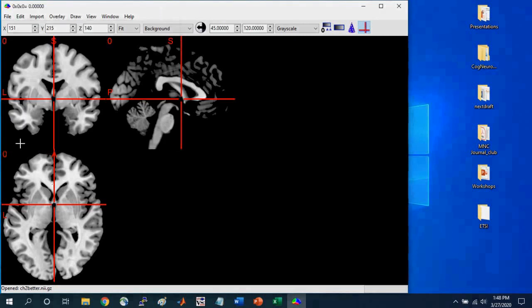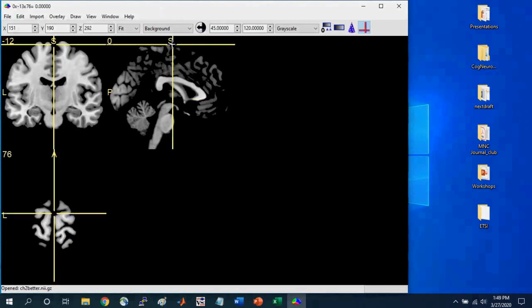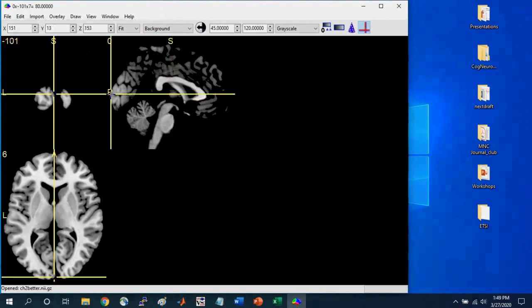So these different letters refer to S means superior, so this is the very top of the brain, so if I click up on the S. P means posterior, so if I click here, it's the very back of the brain.